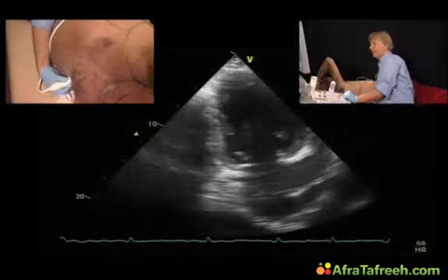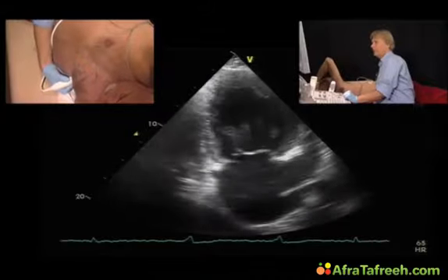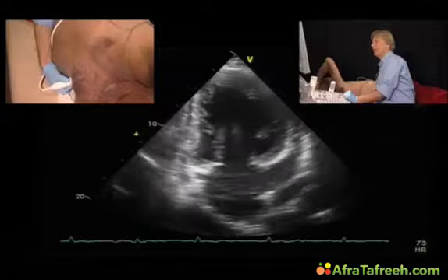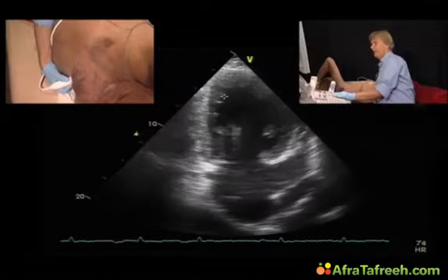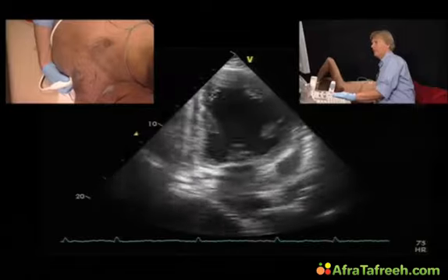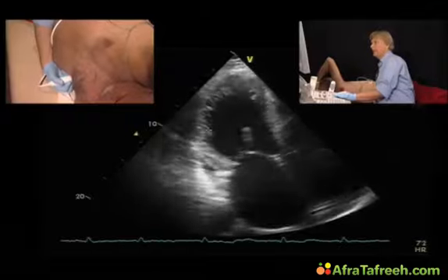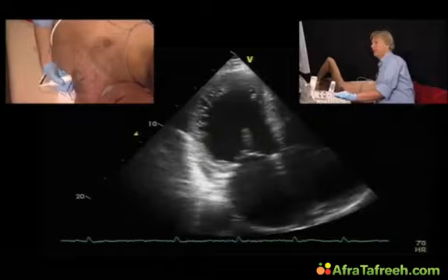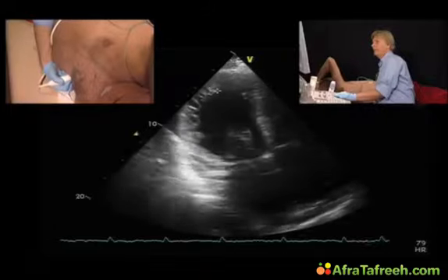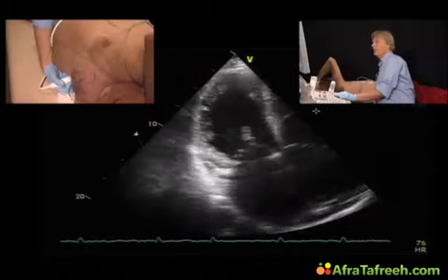And if we look at the regional wall motions, again, we see that there are regional differences. Even though the patient for sure has dilated cardiomyopathy, he has a normal angiogram, and we see a wall motion abnormality here. This part of the inferior wall is actually akinetic. And also the posterior lateral wall seems to be less contractile than the remaining portions. Also take a look at these trabeculations here. Maybe there is some rudimentary form of hypertrabeculation here.